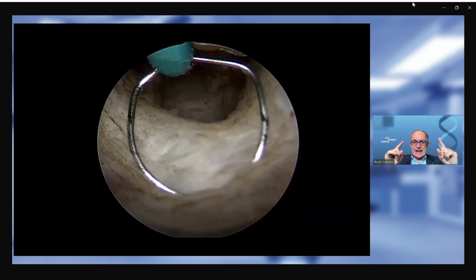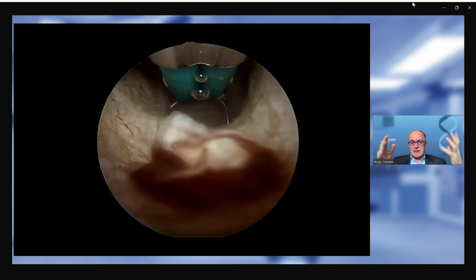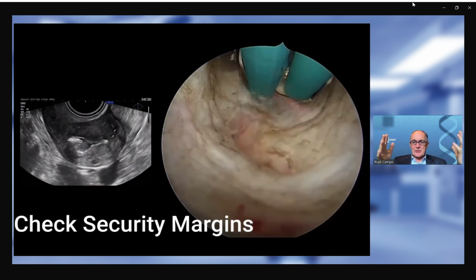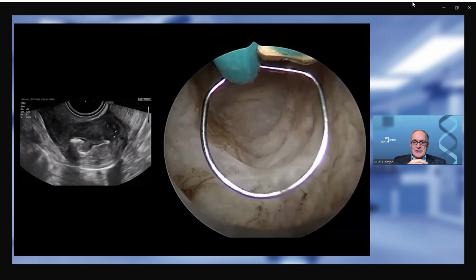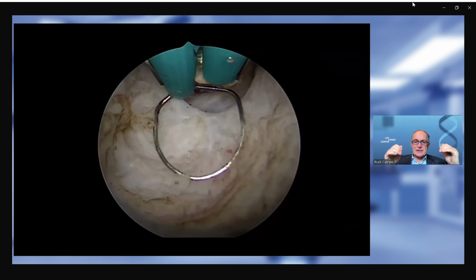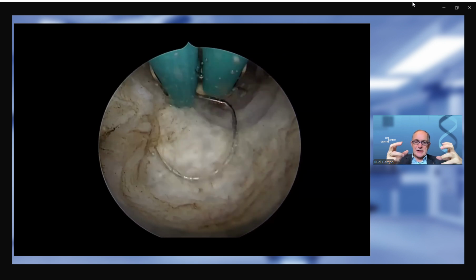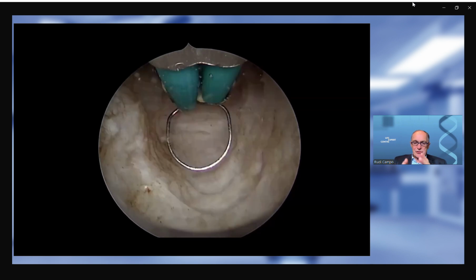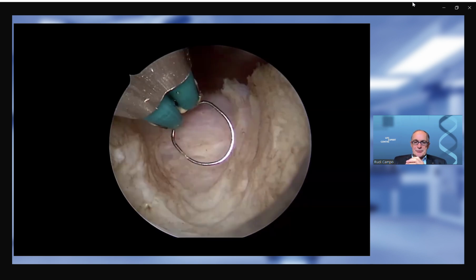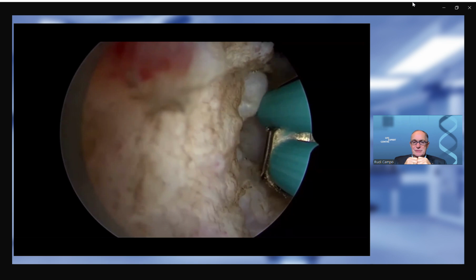And the adenomyotic tissue you can differentiate from the surrounding, you call it pseudocapsule or whatever, but from the surrounding myometrium. And you have a visual reference and an ultrasound guide that you can cut until a certain depth, which looks appropriate, and removal of the fibrotic adenomyotic tissue.